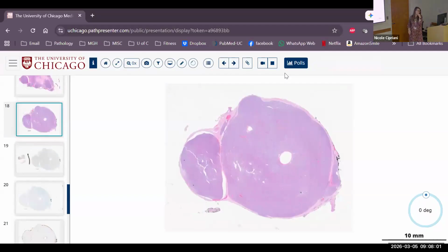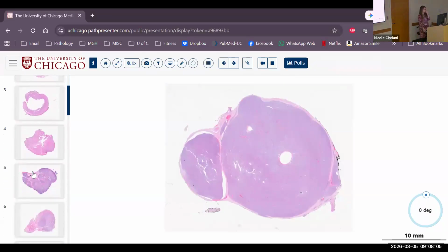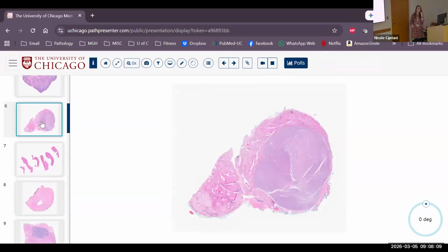What was case 5? It was the one that looked like it maybe was an HTT, but it's not. Oh, this was an adenomatous nodule with trabecular growth.